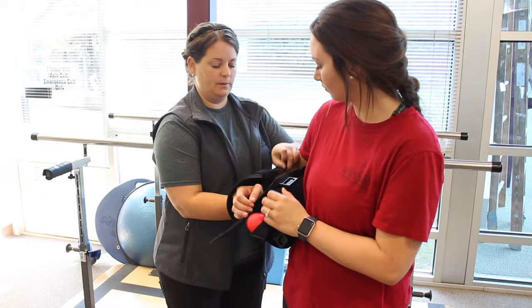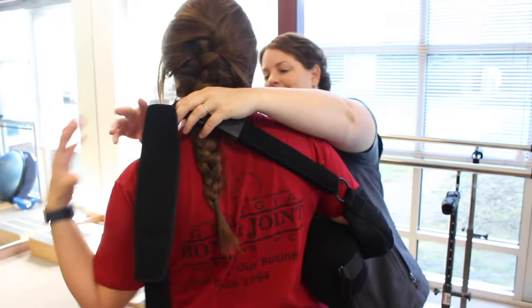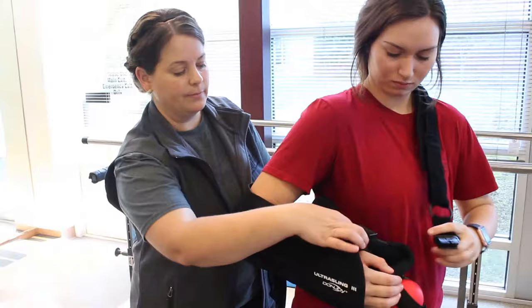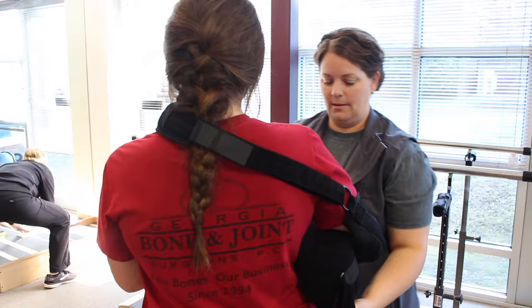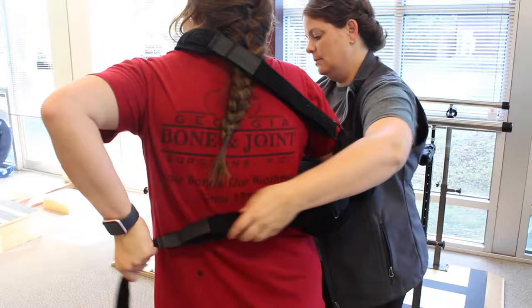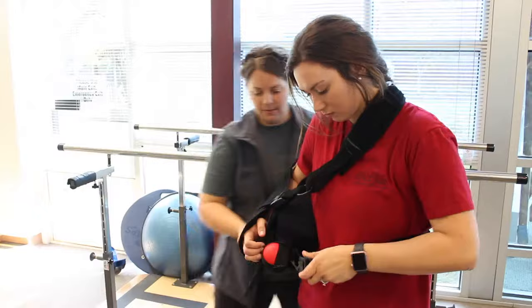Two main straps will help keep the sling in place. The first strap will come from the back of the sling, wrap across your opposite shoulder, and attach to the top front section of the sling. The second strap will wrap around your waist and clip at the front bottom portion of the sling.